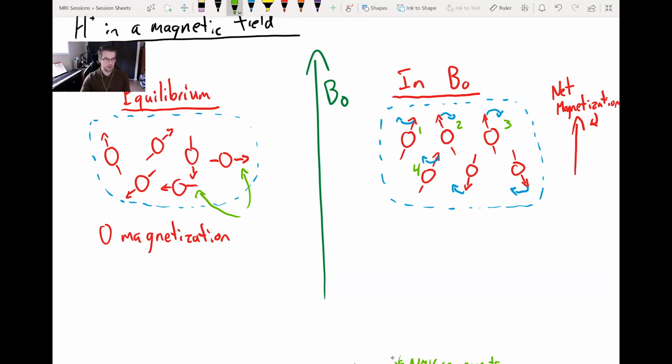But if we think about just their vertical component of that magnetic field, it's upwards. Whereas there are, let's go in purple here, 1, 2 spins that are oriented downwards, right? Again, off axis, but we're only worried about their vertical orientation. So if we're just doing vector addition, adding those magnetic fields together, these ones are going to cancel out those ones, which leaves us with 2 spins that are oriented upwards that aren't canceled out. And that's contributing to this net magnetization field oriented with the B0 field oriented upwards.